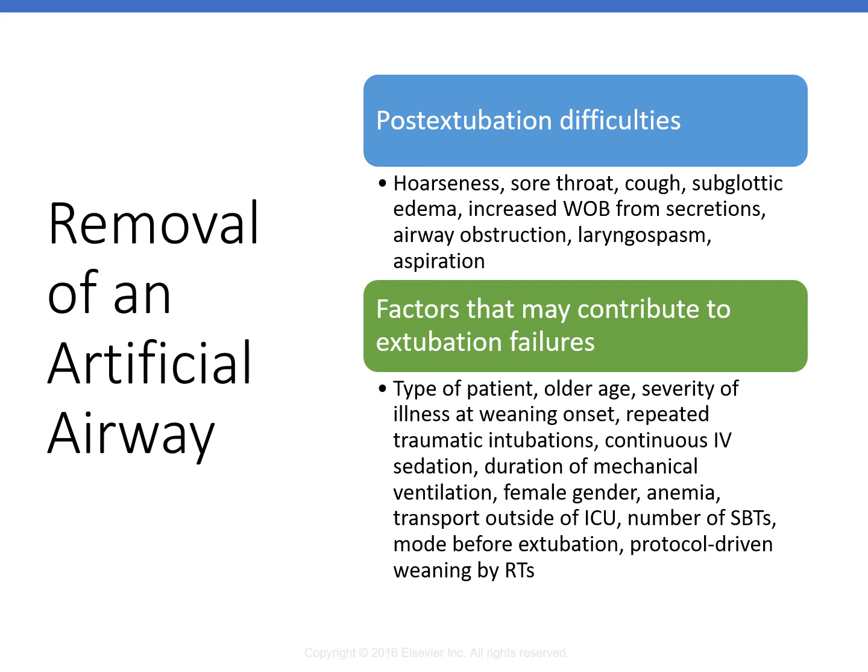Heliox is just a low density gas, right? You're just using low density gas. The big disadvantage of the Heliox is the evidence behind it is a little aged, but physics, it still makes sense that it would work, right? And then you're only giving 30% oxygen, so that may not be enough oxygen support for these patients.